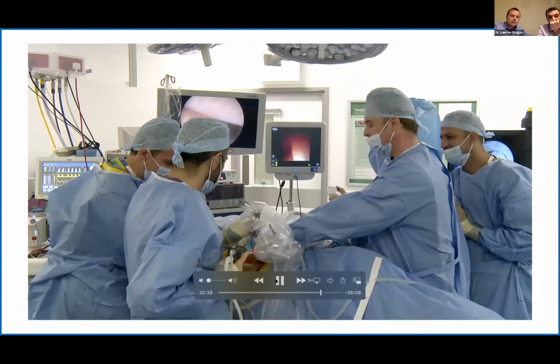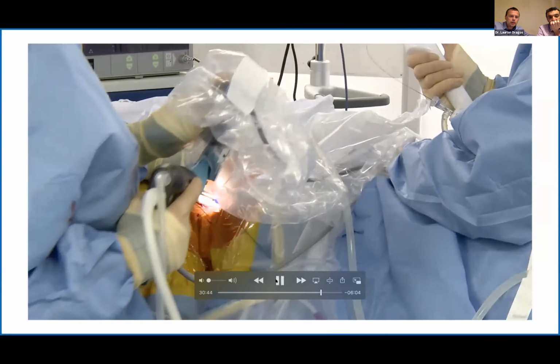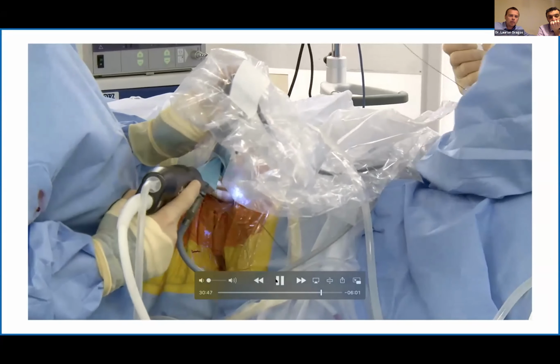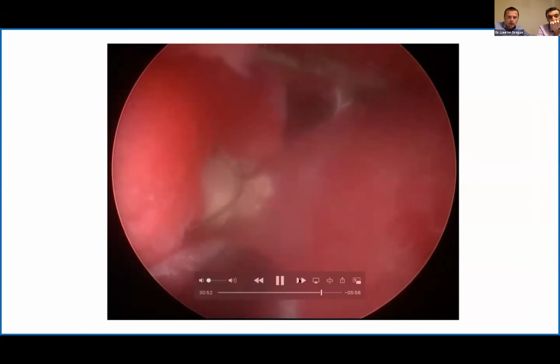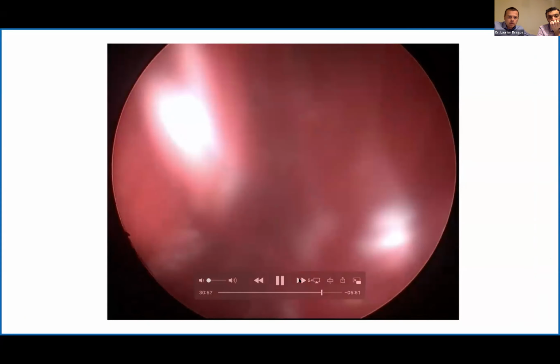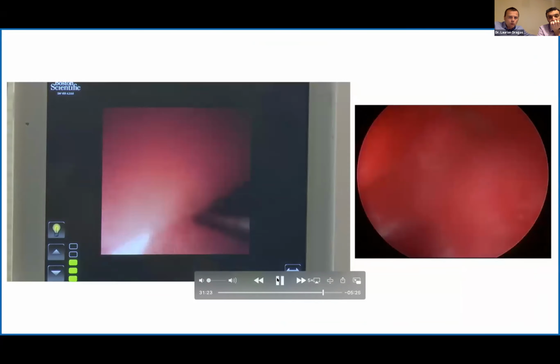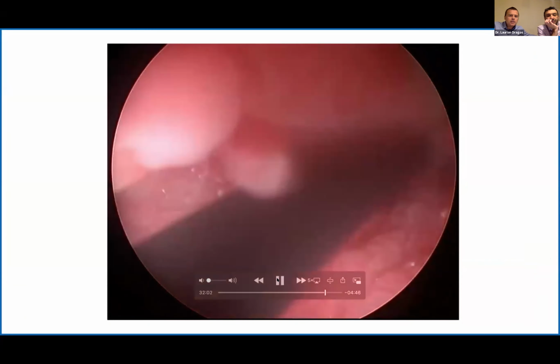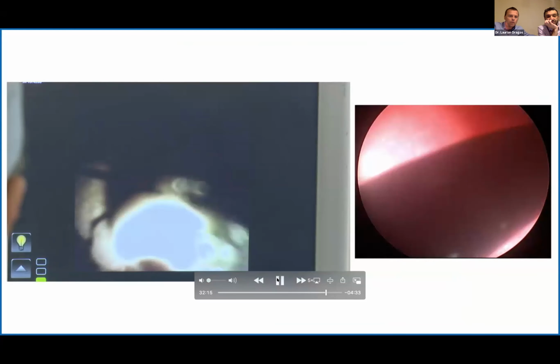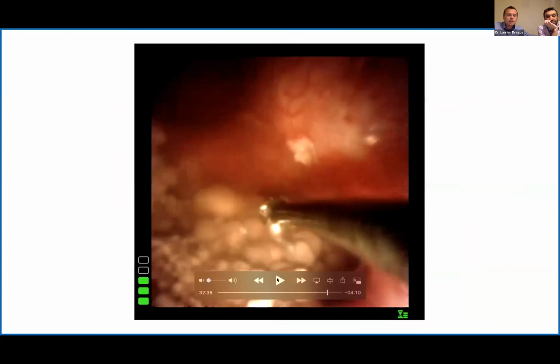So basically he sucks the stone when it's small enough to go through the sheath. He sucks the stone with a probe and removes it. Again, a lot of fragments removed. I'm going to increase the speed of the video now. There's one more thing at the end. Again, I'm sitting sort of away and then sucking, and you see, basically they come to the probe and they are destroyed. You don't have to press against the wall. So that's a lovely demonstration.